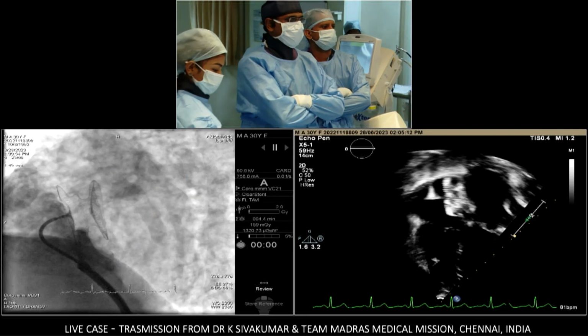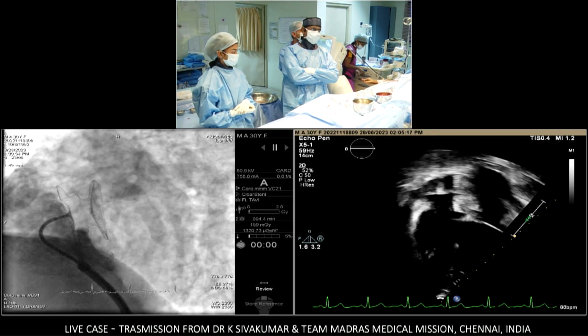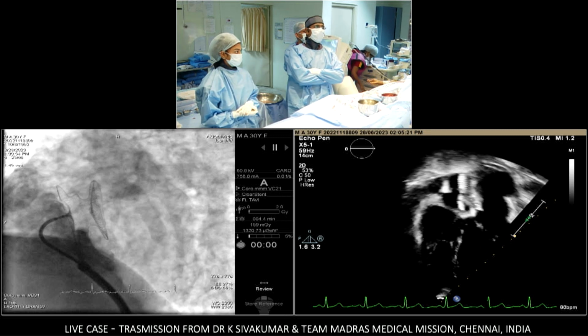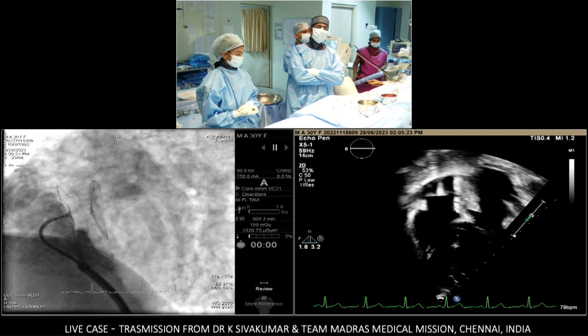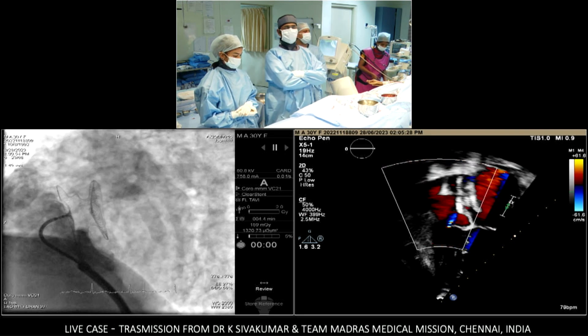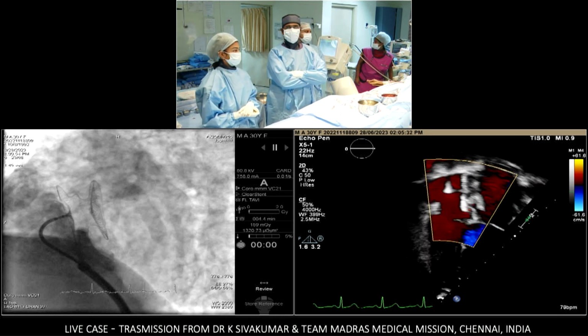See, now look at this. Hello, yes, it's Juan Granada here. Is there a possibility you're putting too much tension in the attachment cable? If you relax, I mean, if you push the cable forward, the device is going to compress and we're going to have a better idea where the device is? I told you that I'm using a Trevisio cable. There is no tension at all. Well, all right, the tension of the system, I mean.